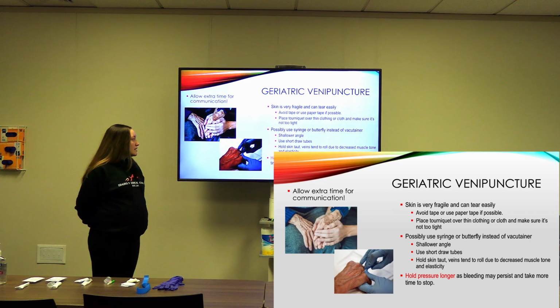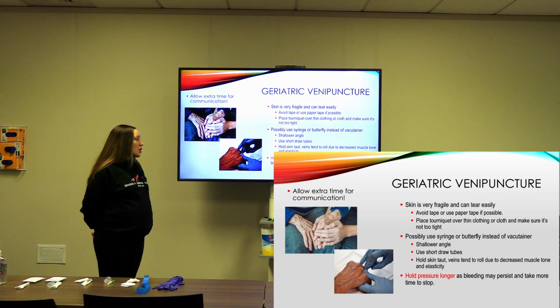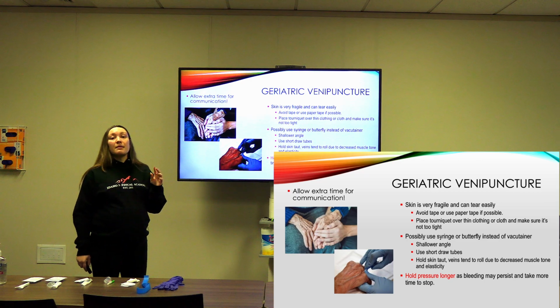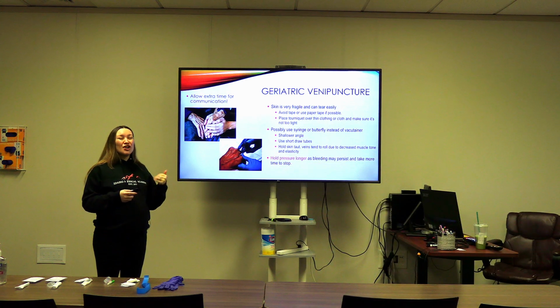So the last thing too with geriatric venipuncture is generally it takes them a little bit longer to clot and to stop bleeding. So we're going to hold pressure longer so that it gives them time for the clotting process to happen. So we're holding pressure longer on geriatric patients.